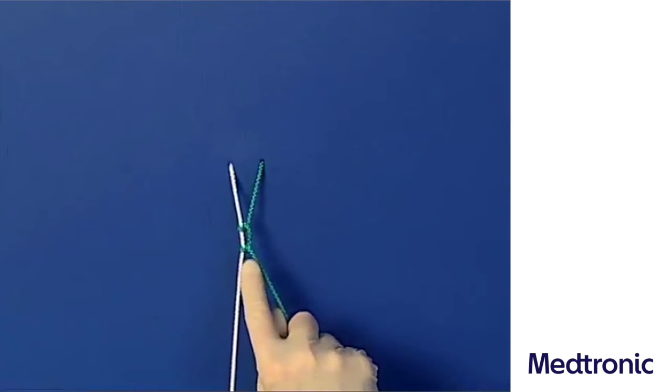When stretching out the index finger, however, the third to fifth fingers can form a fist to save space.